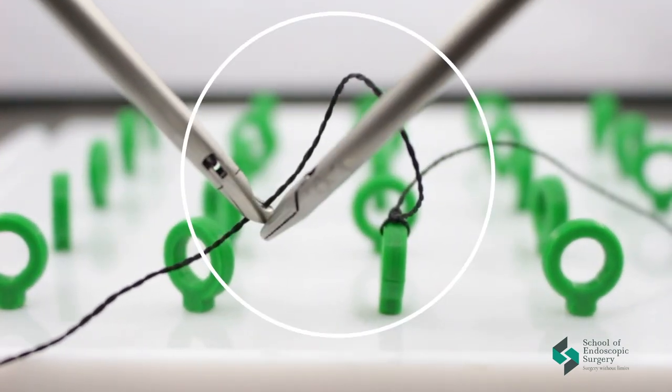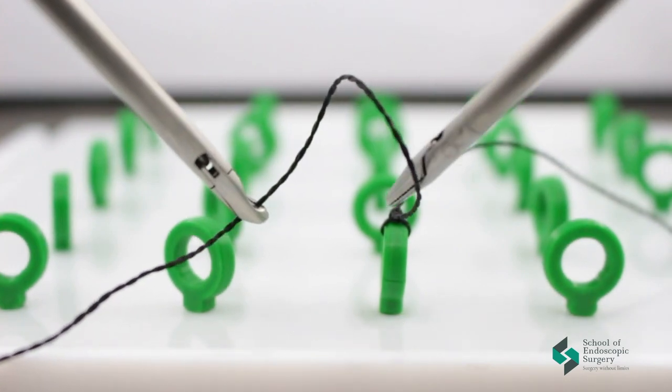The first thing wrong in the video is the directions of the thread. It must always look up.